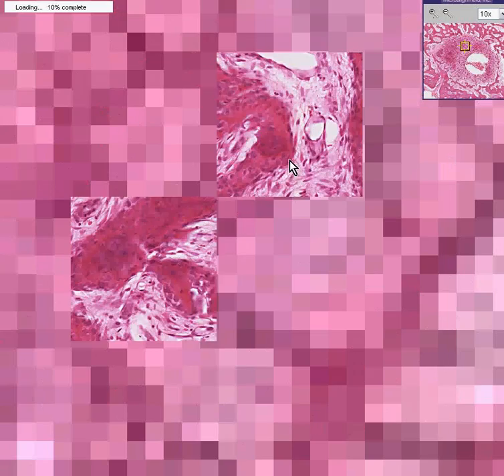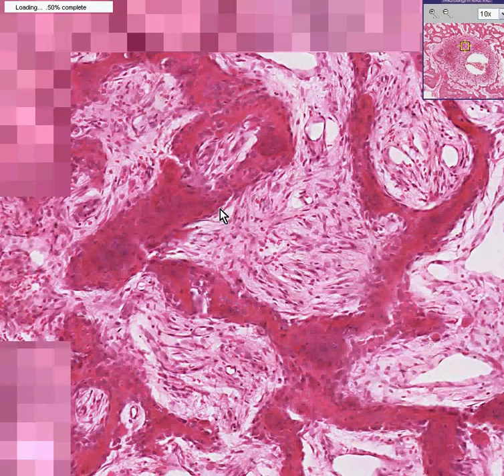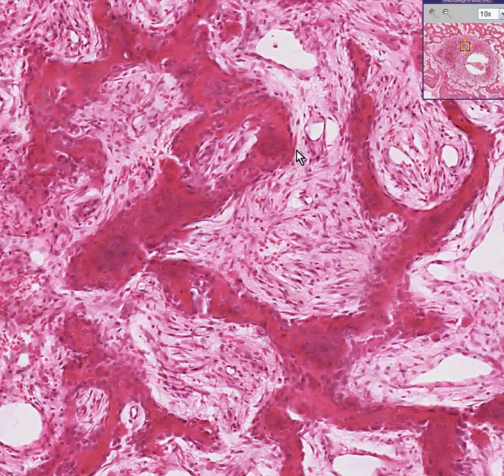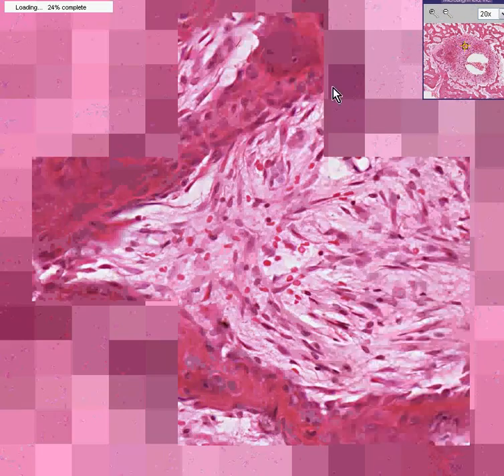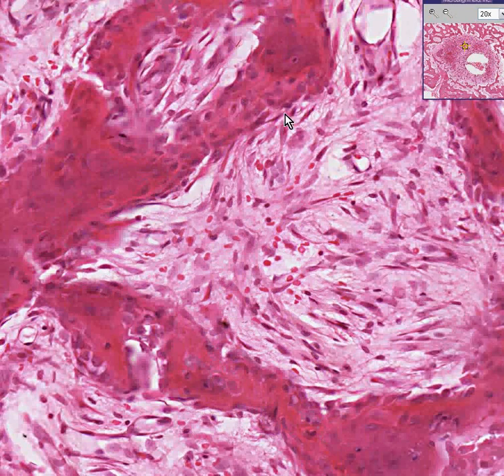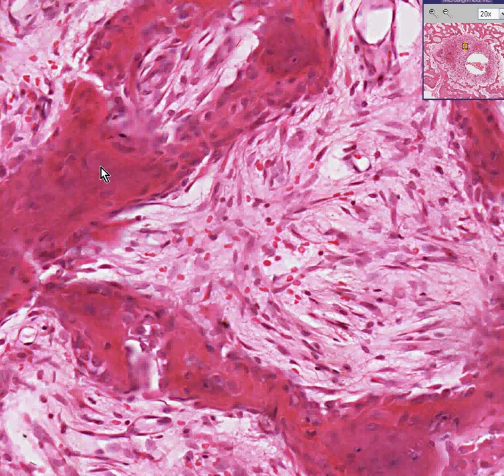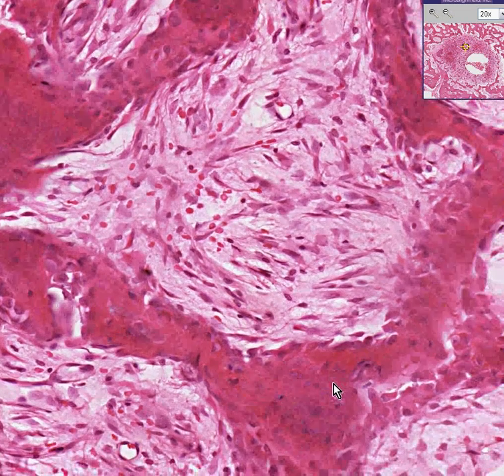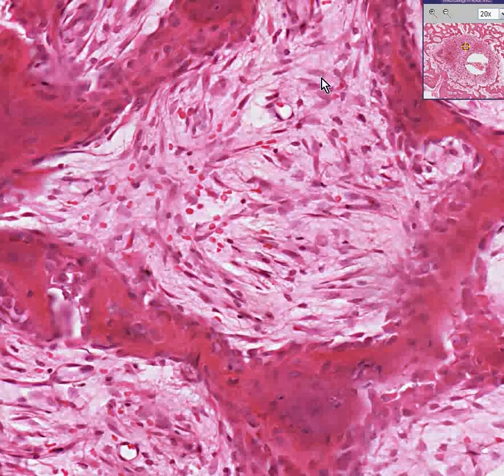The spicules themselves are rimmed by nice-looking osteoblasts here, here, and living within them — within the lacunae — are the osteocytes.